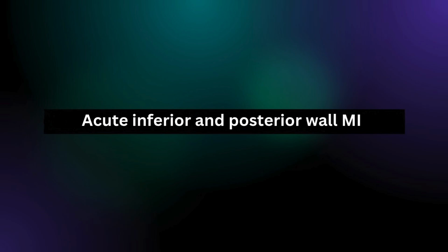Clinical pearls and practical tips. Always double check reciprocal changes to strengthen your diagnosis. Be alert to subtle signs of posterior wall MI changes, focusing on leads V1 to V4. Early recognition of myocardial infarctions can significantly impact patient outcomes.